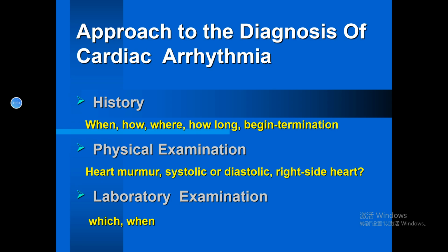So if there's an EKG in front of us, what should we do? Should we diagnose the ECG directly without any kind of information? Obviously, before we diagnose an ECG, I think there is a lot of information we should collect, because some information is really important and helpful for us to diagnose an ECG.